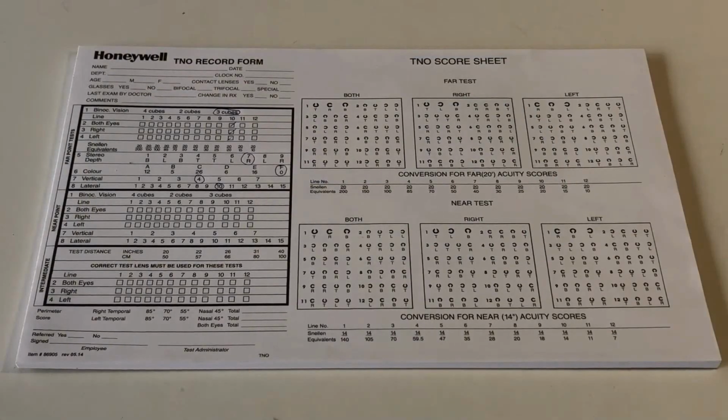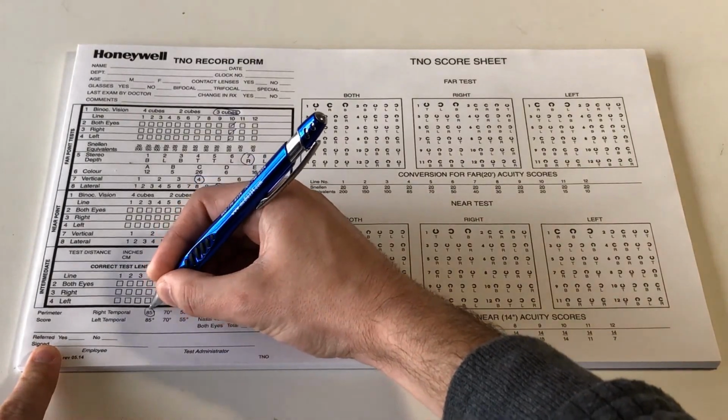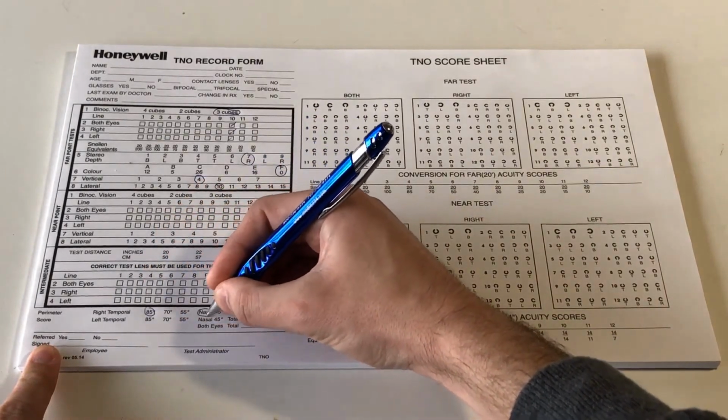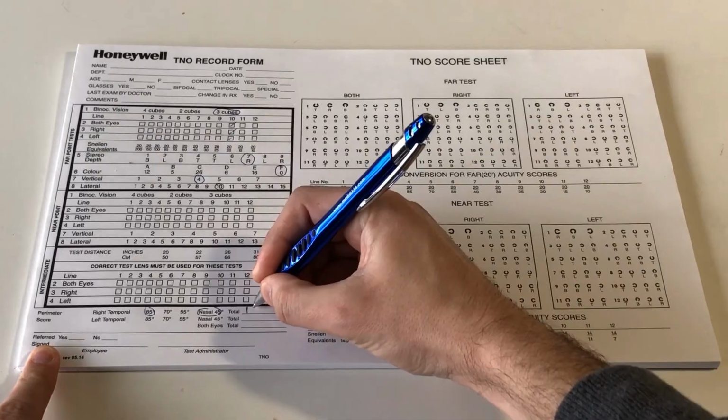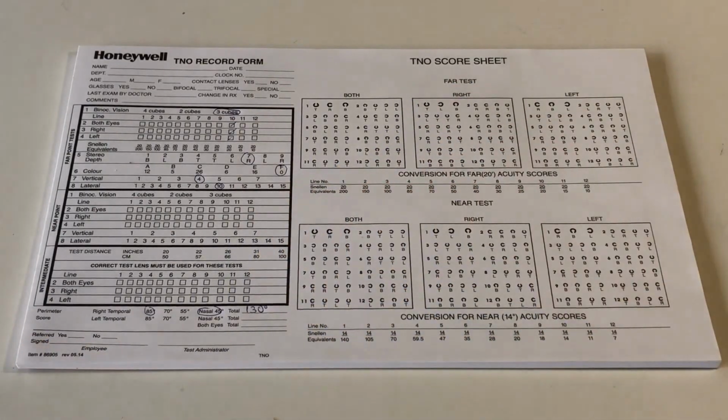On the record form, we record the total field of vision the patient was able to perceive, which is the temporal results added to the nasal result. For example, if the patient was able to see all of the lights, their temporal field of vision would be 85 degrees and their nasal field of vision would be 45 degrees, for a total of 130 degrees. Repeat the procedure for the other eye.